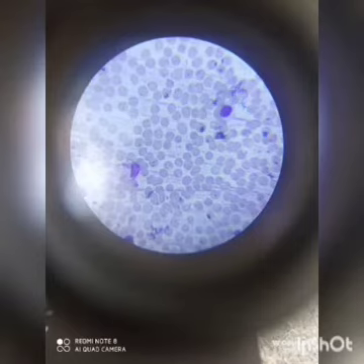As we reach the head end, again move 2 fields down and scan the smear towards the tail end in this method till you have examined 100 cells. When counting has been done, calculate the percentage of each type of cell in your count of 100 white cells.